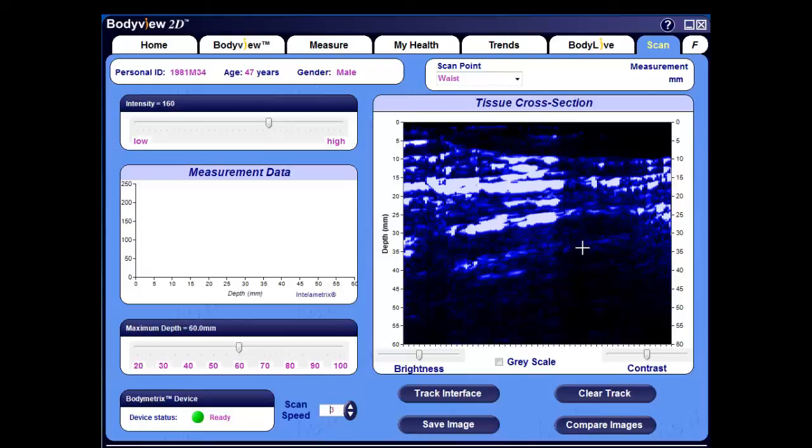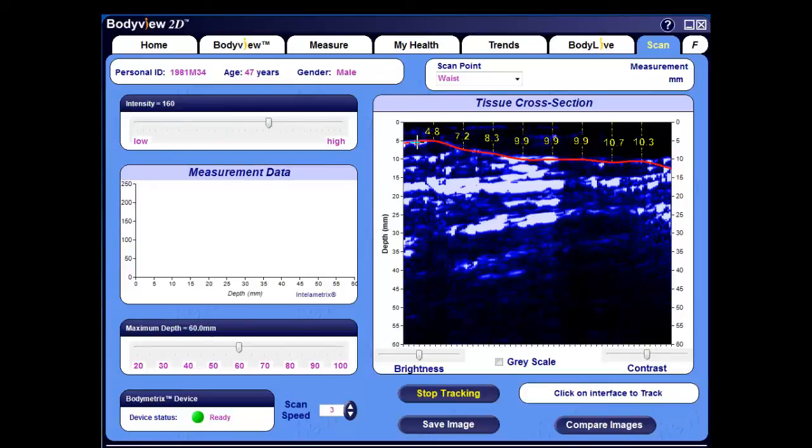We can also track the various interfaces and quantify both the superficial as well as the deep adipose tissue layers. Click on the Track Interface button and place your cursor in the center of the fascia signal as shown, and then click. You can adjust the tracking by setting your own data points by moving your cursor to the desired area, and then clicking again to adjust it. Once you're satisfied with the tracking, click the Stop Tracking button.